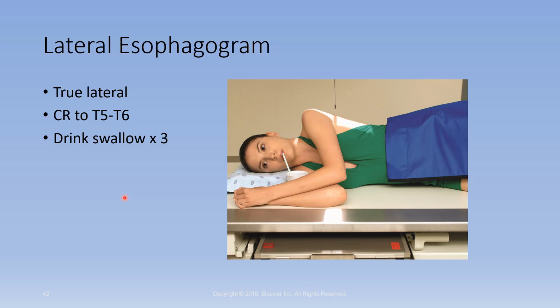On the lateral, your technique would be 110 kVp at 4 mAs for single, and you'd be 100 at 4 for double or water soluble.